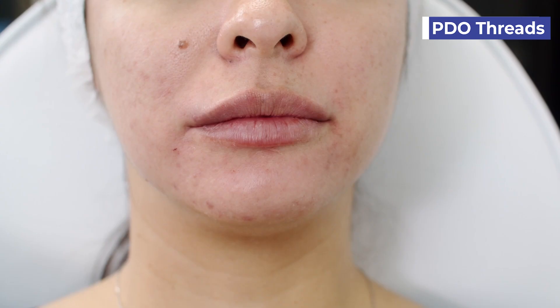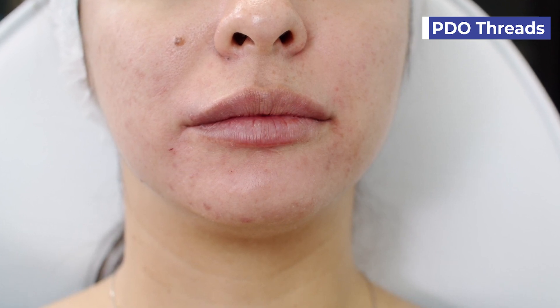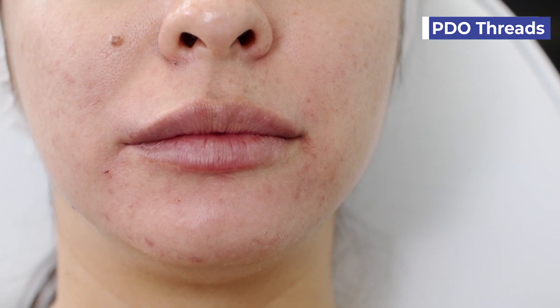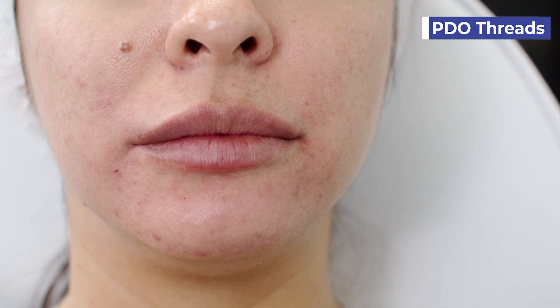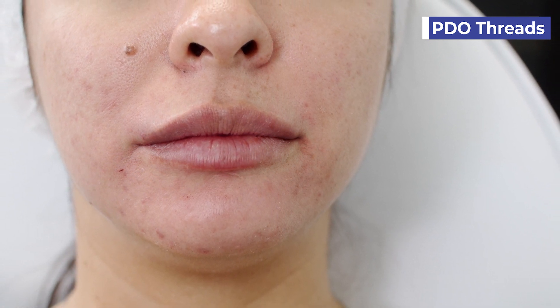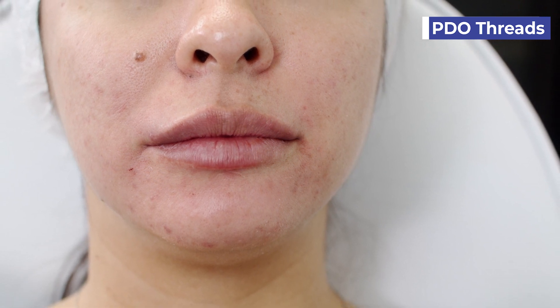The patient today has already had lip filler for lip augmentation. We already enhanced the vermilion border as well as the body, but you can also use PDO threads in conjunction with fillers and neurotoxins to define, contour, and volumize the lips even further or to help any other deficits. This patient already has a nice defined enhanced lip volume and border on the vermilion border, and we also did a little bit of filler in the oral commissures.